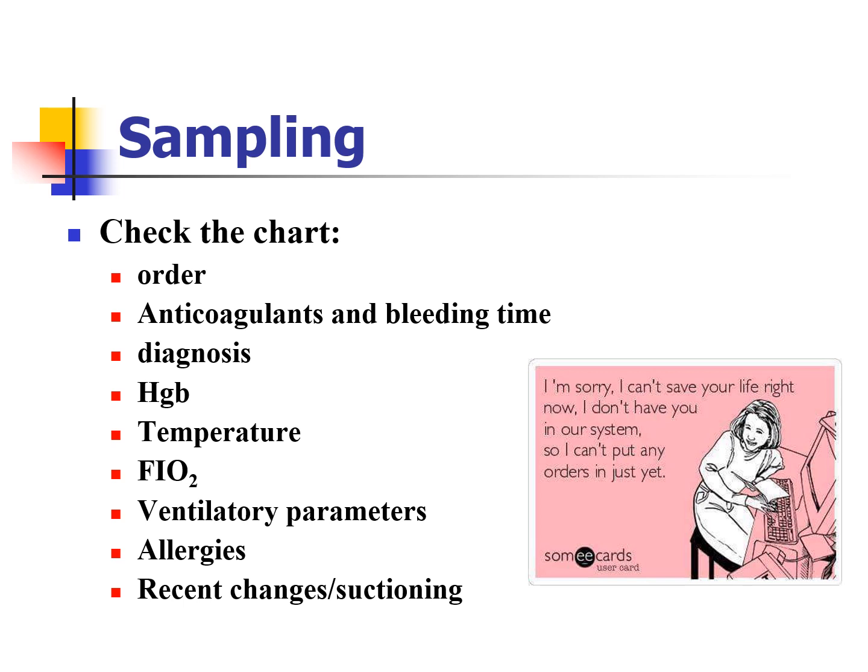What's the patient's temperature? Like I said, every time you do blood gas, you need to get what their current temperature is. How much oxygen are they currently on? Right, that's a big thing to chart because it's going to tell you how much oxygen they were on, if it's undercorrected, corrected, or overcorrected. Vent parameters, how much pressure are they on, and how much FiO2 are they on, right? Those are the big things we look at with the ventilators. Do they have any allergies, especially to things like the Band-Aid, right? Anything to like latex or anything like that.